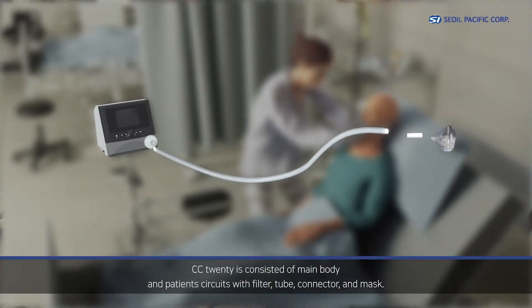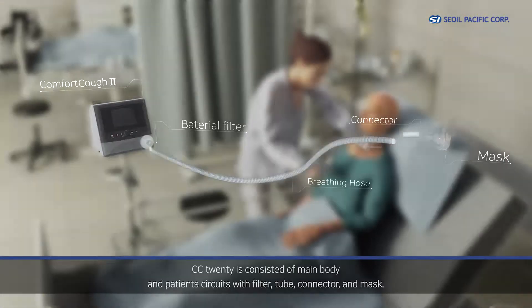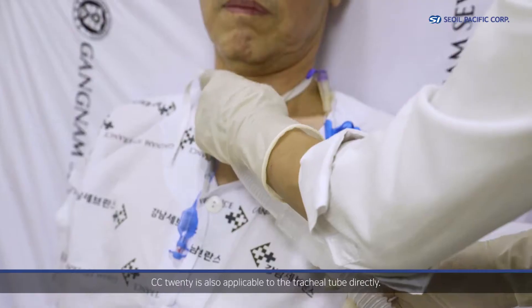CC20 consists of a main body and patient circuits with a filter, tube, connector, and mask. CC20 is also applicable to the tracheal tube directly.